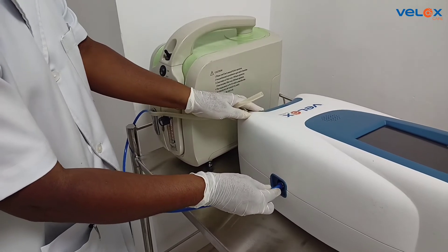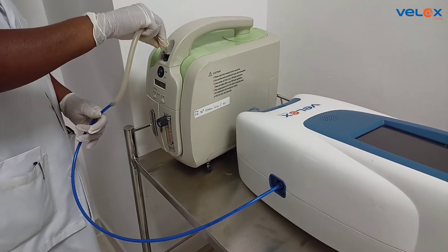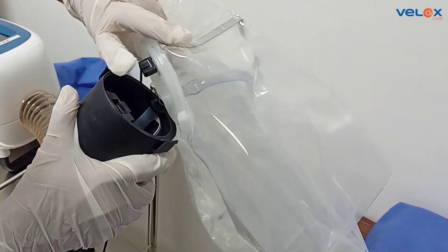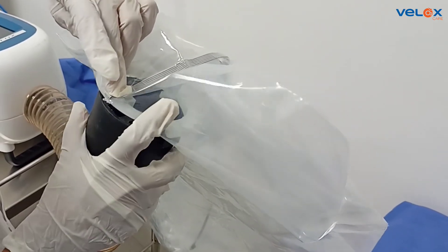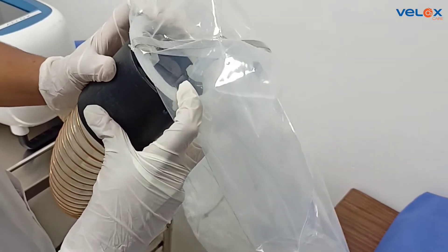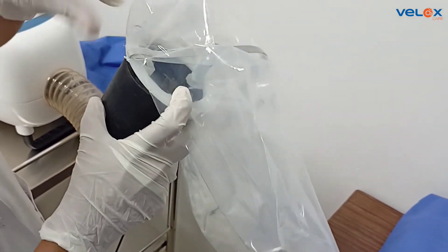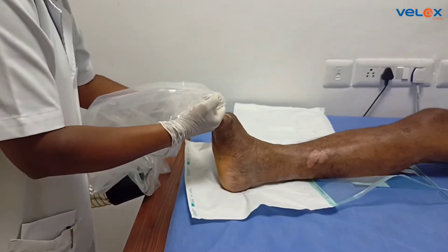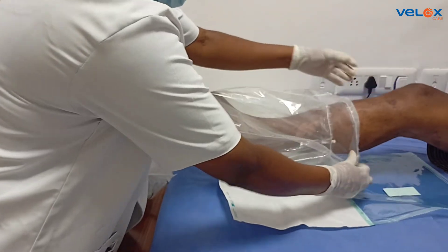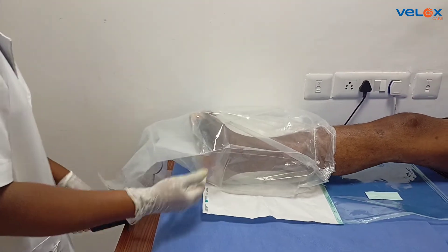Connect the silicone pipe to the oxygen generator from the VLOX warmer. Connect the hose end connector of the warmer to the back end. Insert the limb with the ulcer inside the therapy bag such that the ulcer area is inside the inner therapy bag.